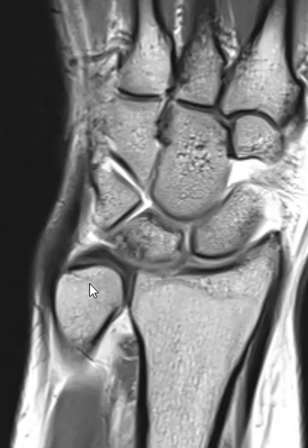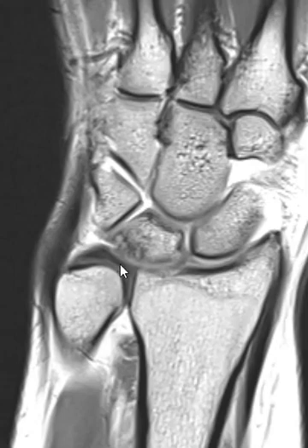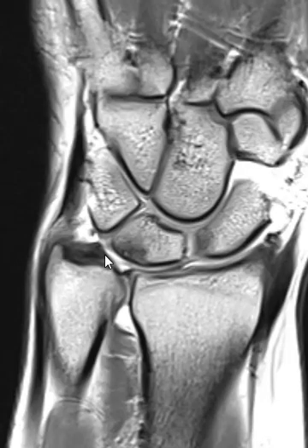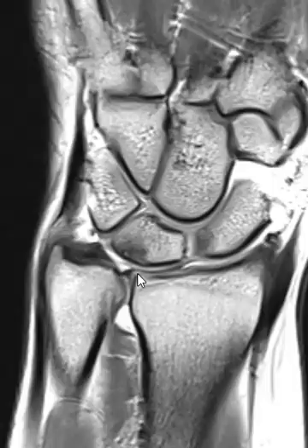It looks like the styloid and foveal attachments are both intact — they just blend together as one. If we go off to the dorsal aspect, we see the dorsal band coming across here; it looks nice and dark and uniform. We go back to the middle cut — this is where we should see the central disc, from right here to right here, but instead we see a bare area. So it looks like a full-thickness or near full-thickness tear involving that distal articular surface of the central disc.